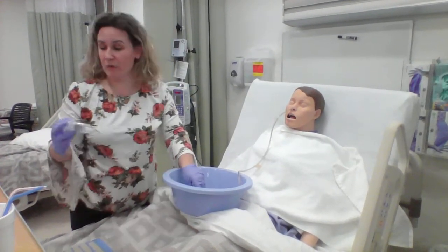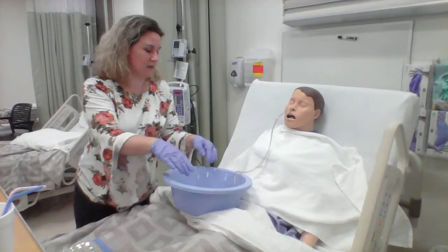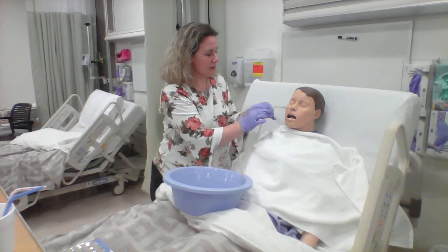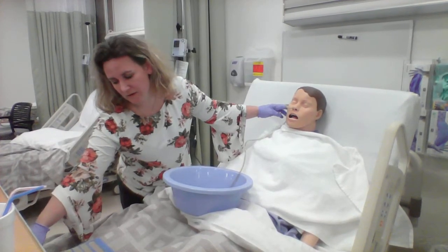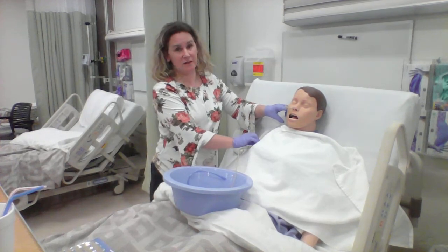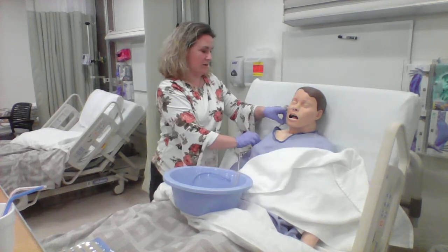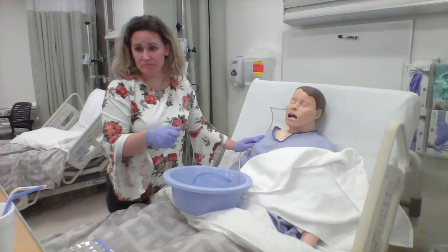And we know we're in the right spot. We'll go ahead and plug this so that there's no leakage. Then we're going to go ahead and tape it to the side of the face. We're going to take your vital signs. You're going to take your blood pressure, and we're going to pretend like we're doing that. And then I would also get a pin and secure it to their gown right here on their shoulder. Perfect. And we're done, right?